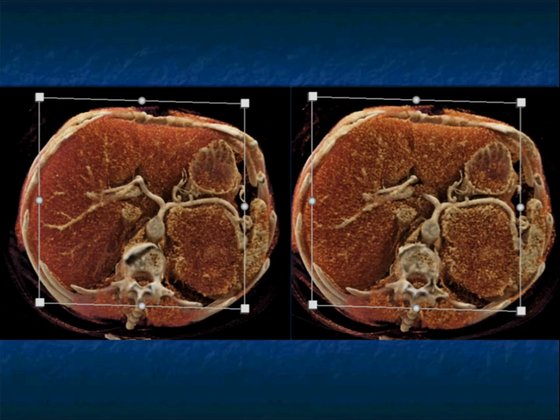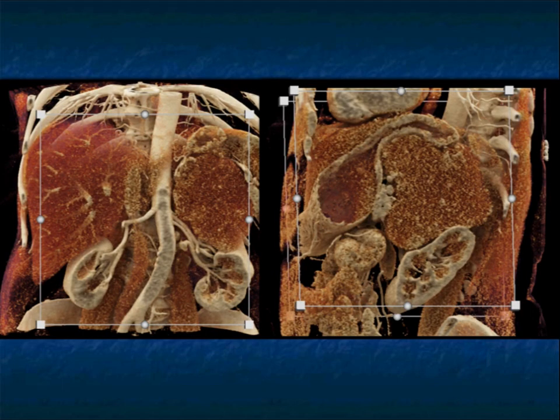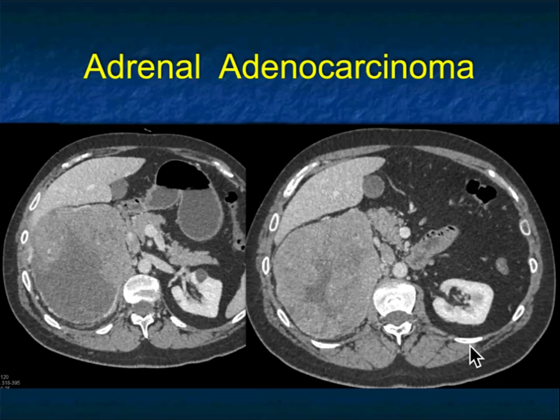Cinematic rendering nicely shows the mass, and the sagittal 3D shows it pushing on the stomach and the left kidney. Every once in a while a large left adrenal mass can be confused with a GIST tumor — I've seen a few GIST tumors called adrenal tumors at pancreas conference and vice versa.